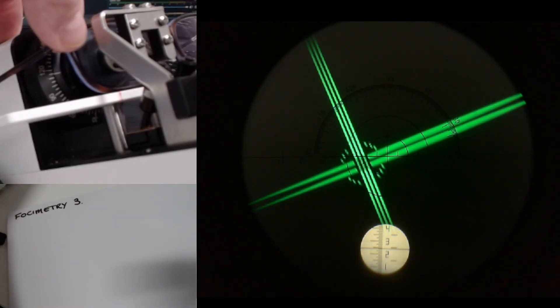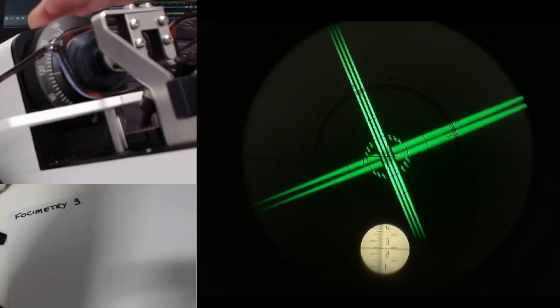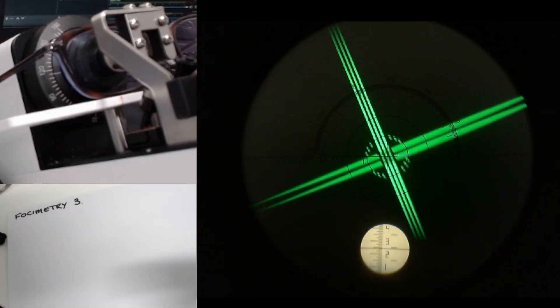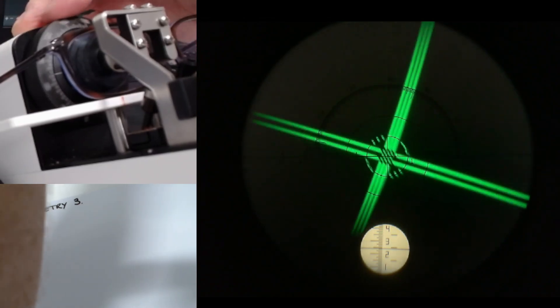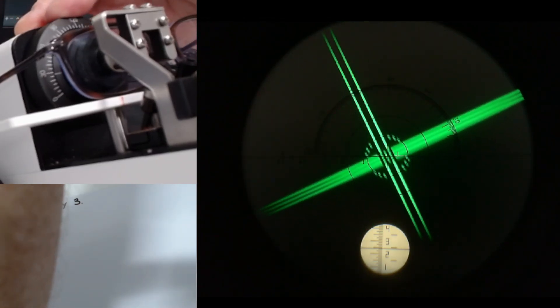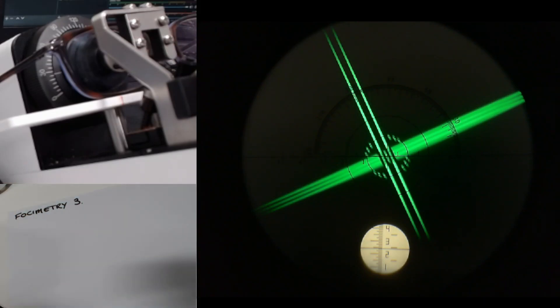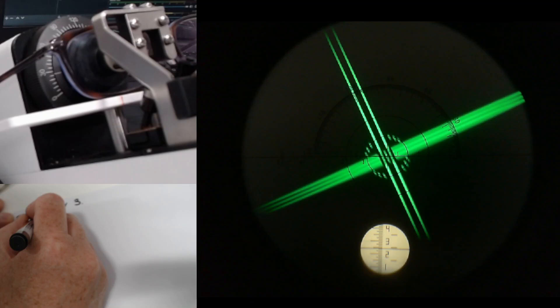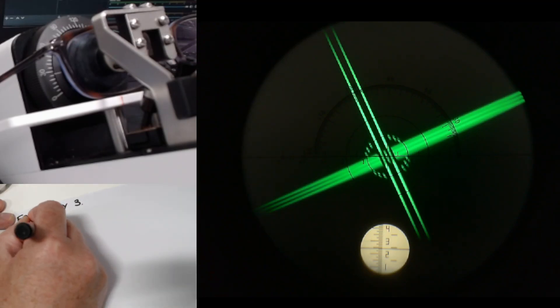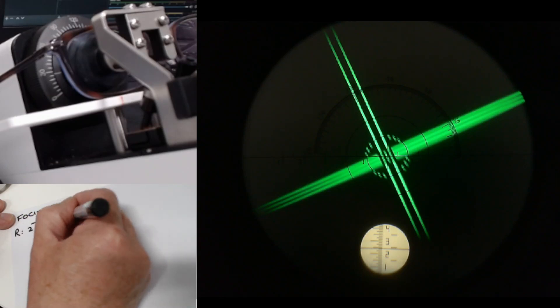I'm going to move that into the middle of the display. I can see that pretty well — I'm going to turn the axis until the two lines line up with those little dashes. So, right lens — it is minus 2.50. Then we're going to leave space for the cylinder.